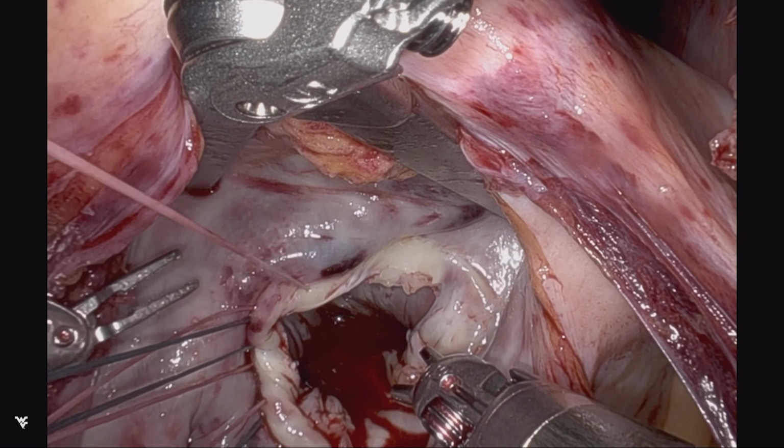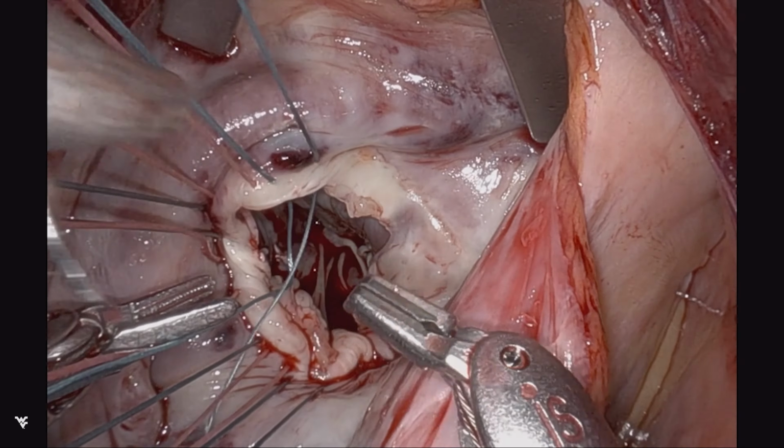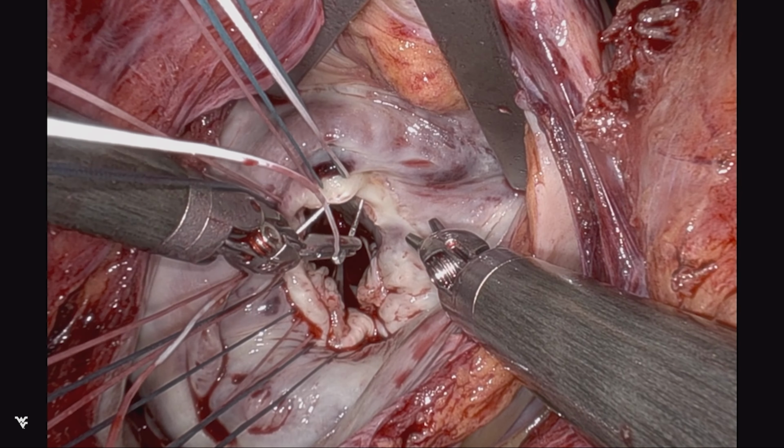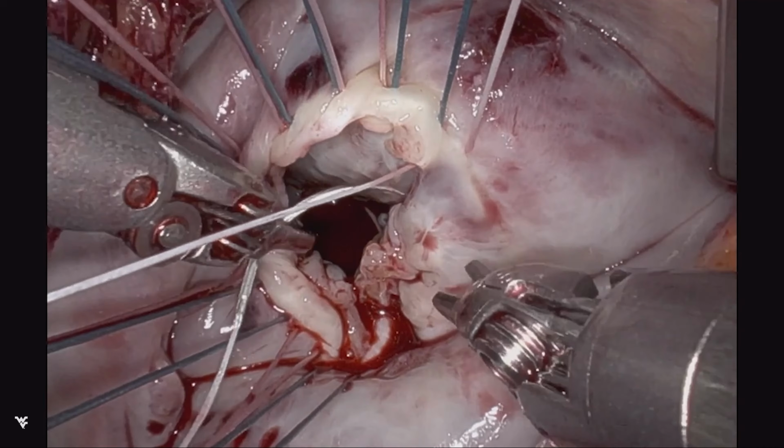And as you'll note, in the anterior leaflet area, I use the anterior leaflet as its own auto-pledget, if you will, by folding the residual component on itself to have extra strength with the tissue, similar to what we do on the posterior leaflet. So the surgical principles remain the same.